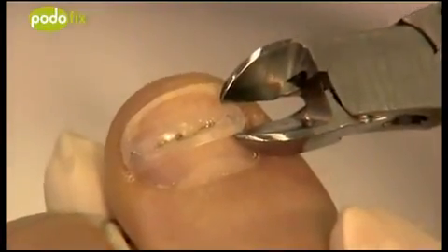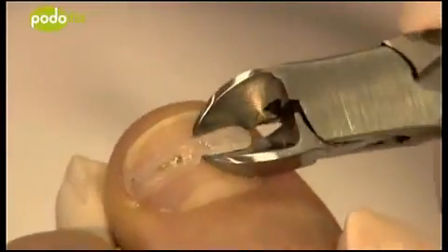The brace is removed using the side cutter at the edges. Remaining adhesive can then be removed from the nail using a file or a milling device.